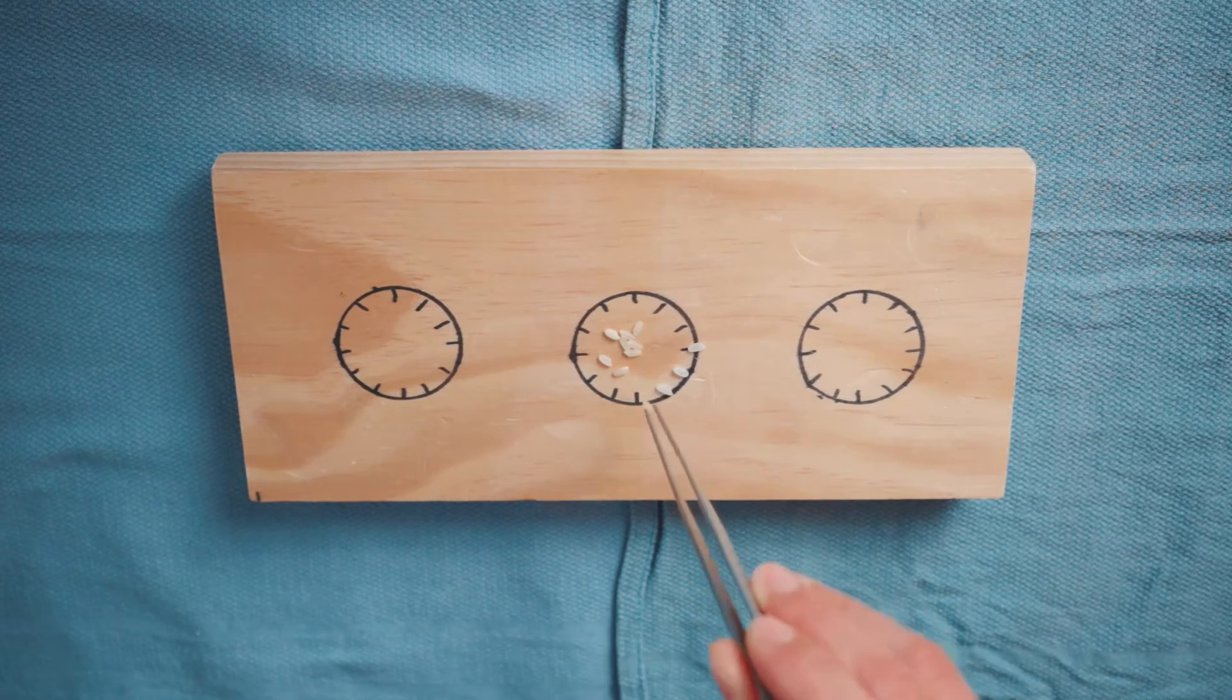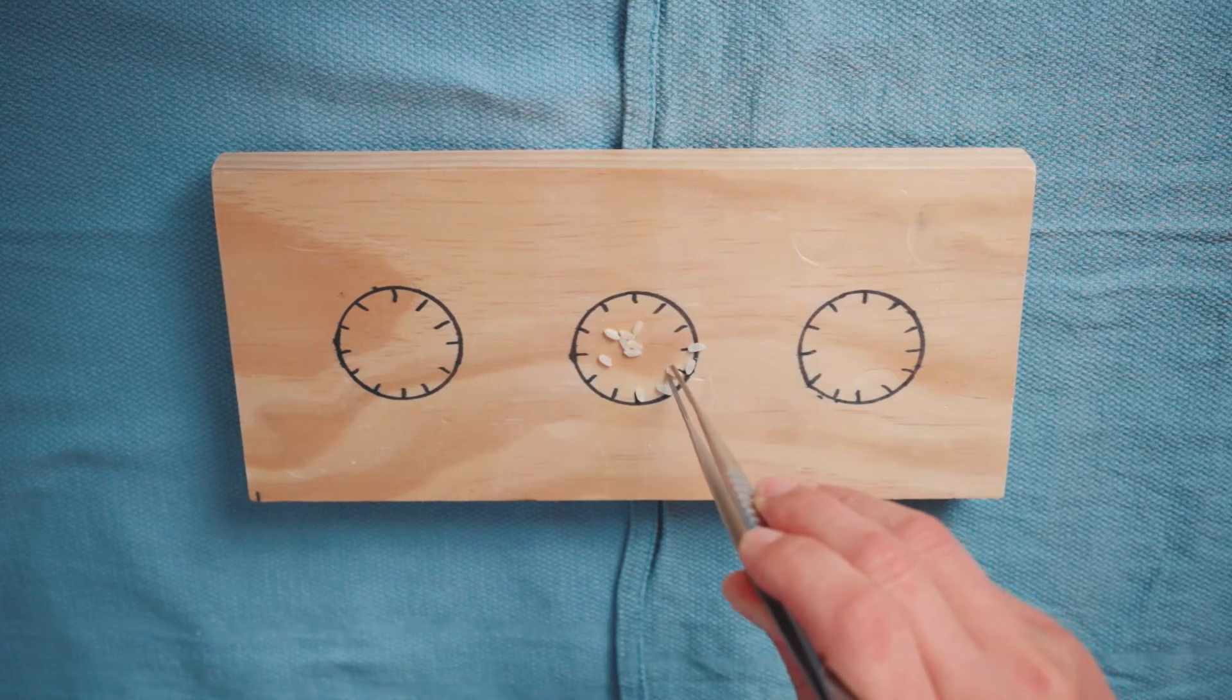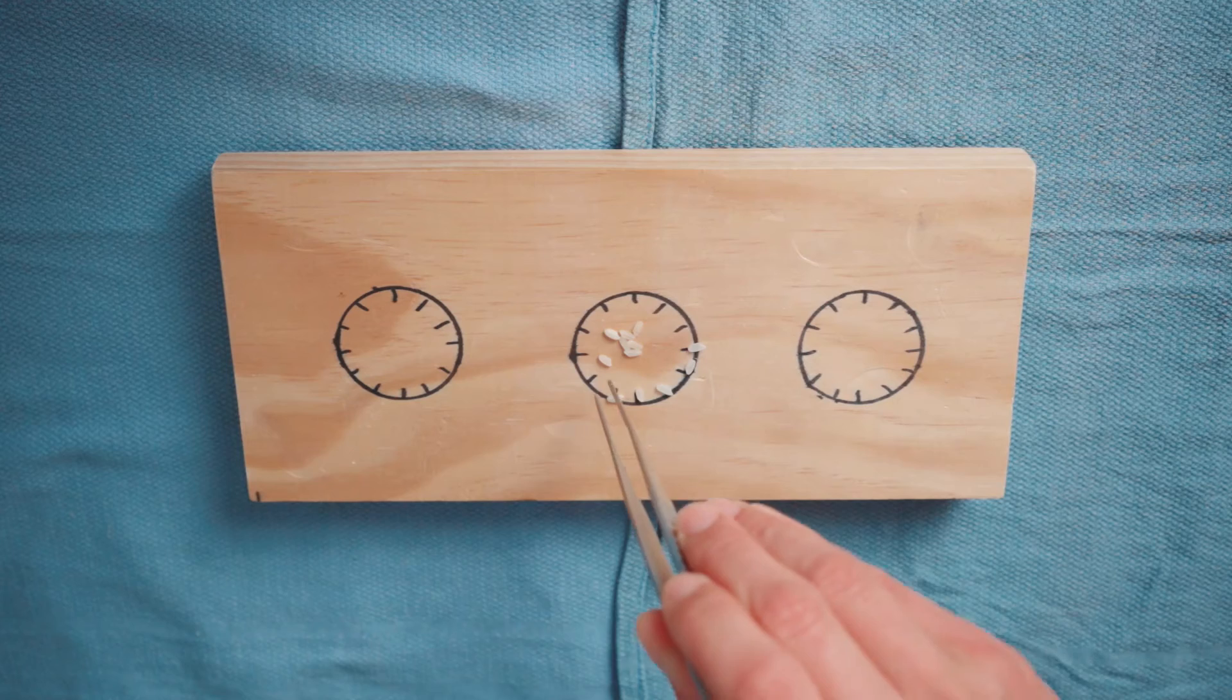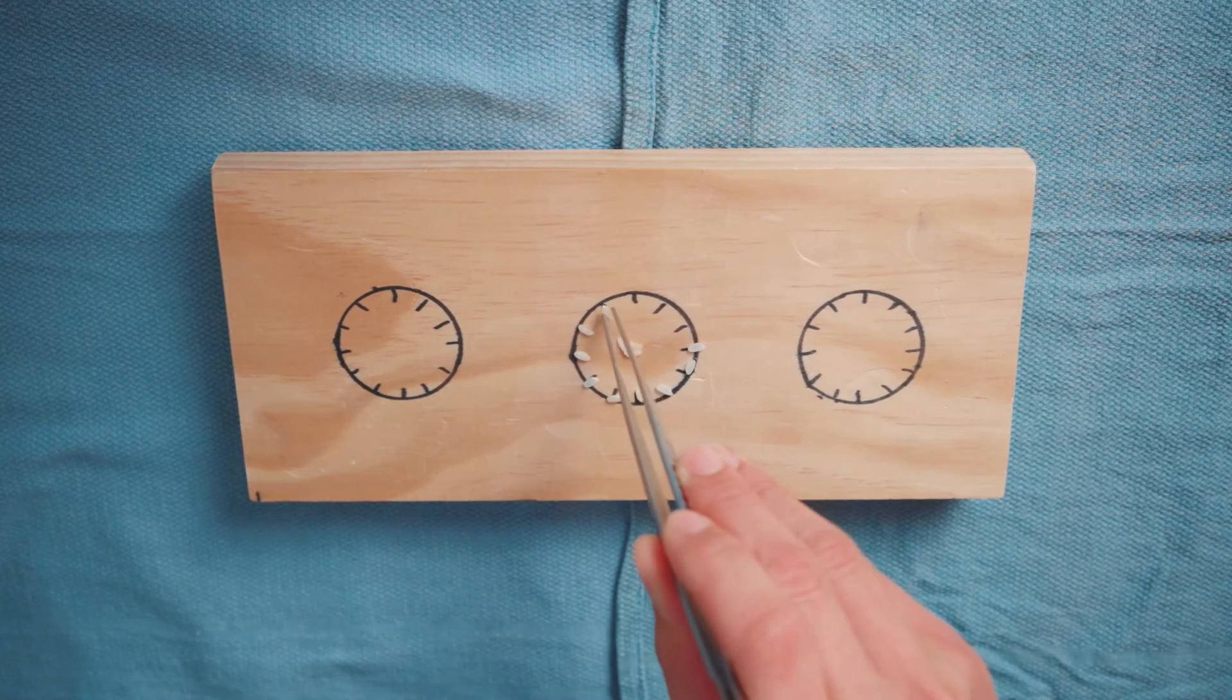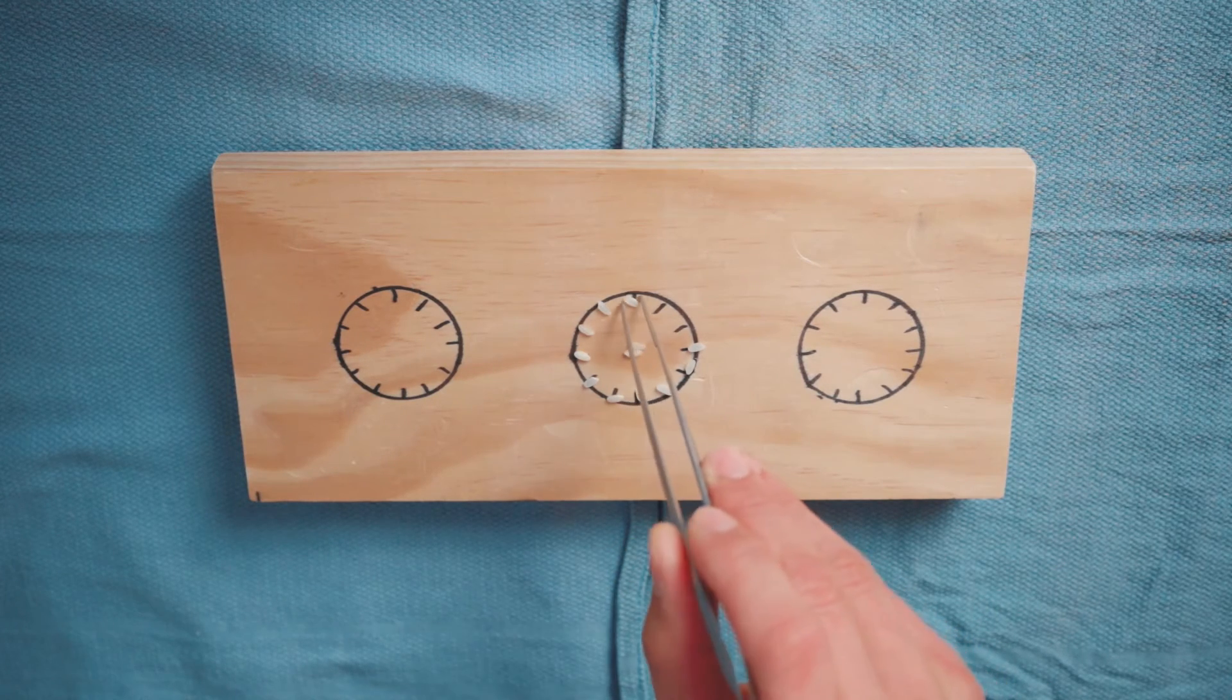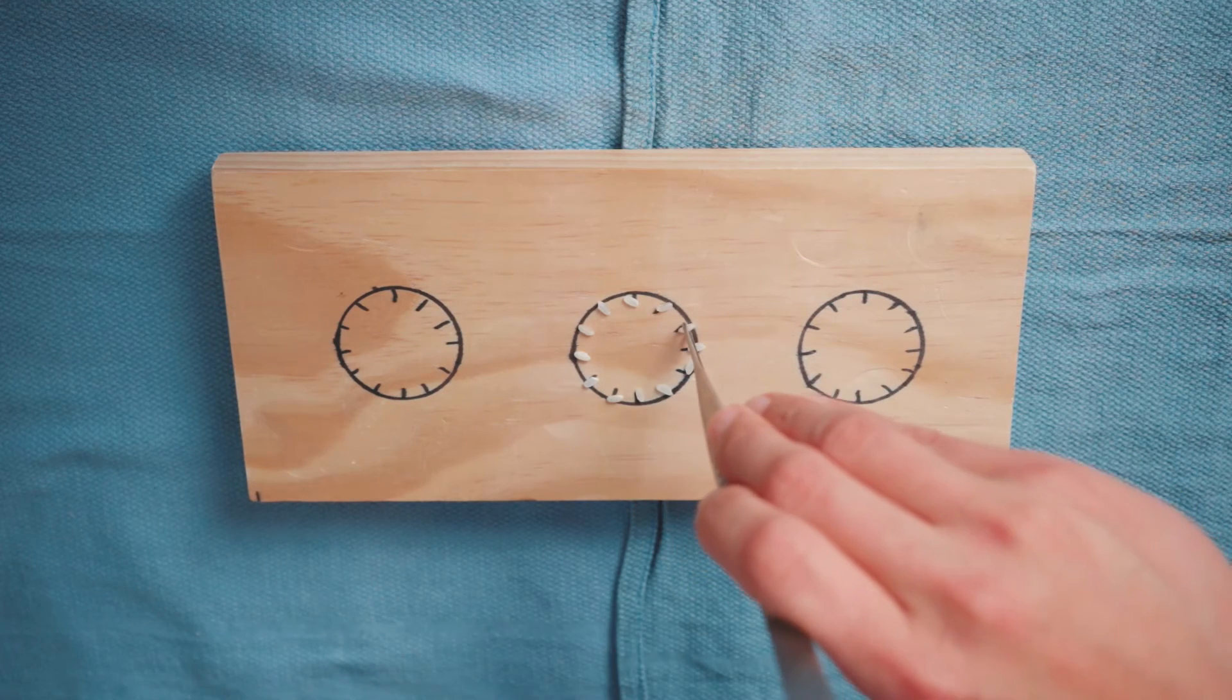You can see that the different positions of the dial really force you to adjust your wrist position and angles accordingly. And you have to be careful to pick up these pieces of rice in the way that they're laying down because otherwise they would pop out of your forceps.